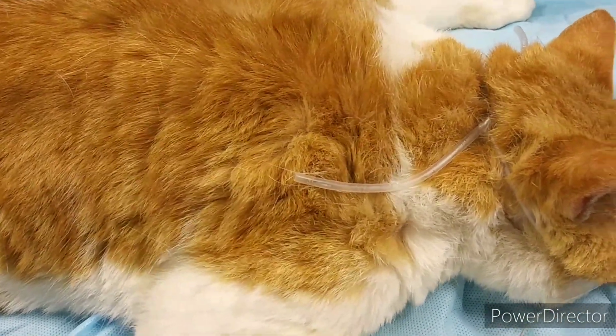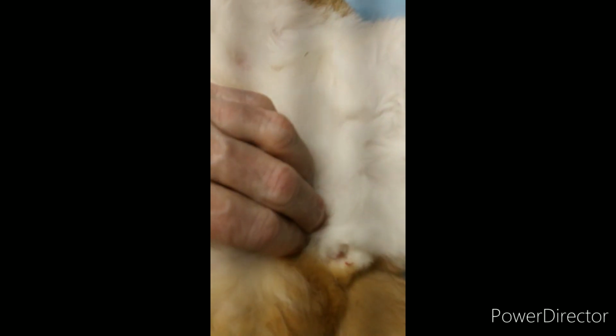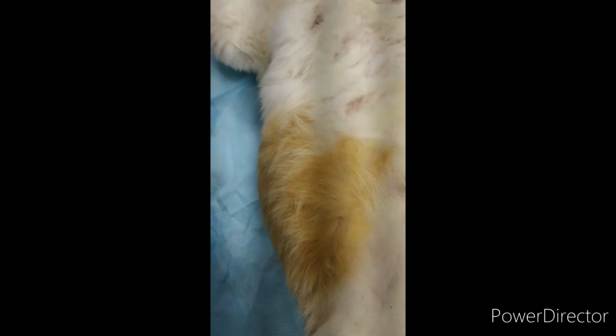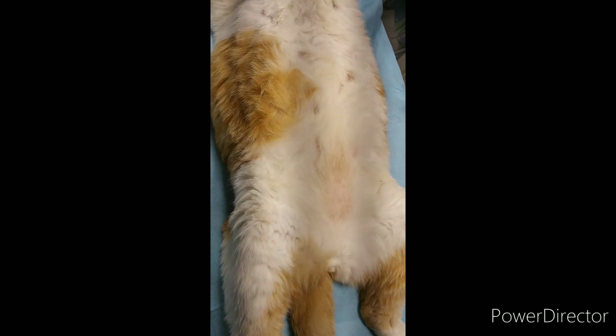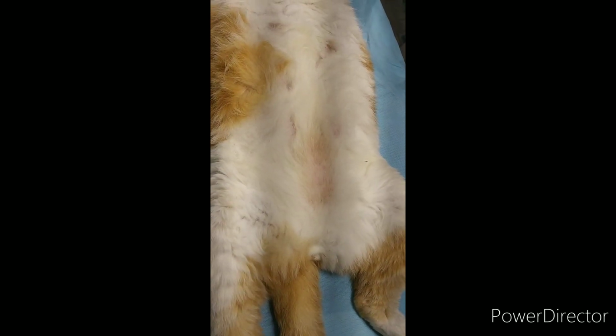Put the little sensor back on there. I prefer them to be positioned like this when I'm going to catheterize them. Notice the blood. Okay. Alright, heart rate, respiratory rate, pulse ox, all that's good. Rectal temp, he's warm. This table is heated, so let me go ahead and put the catheter in. It shouldn't take more than 15-20 minutes. It depends on how obstructed the urethra is.